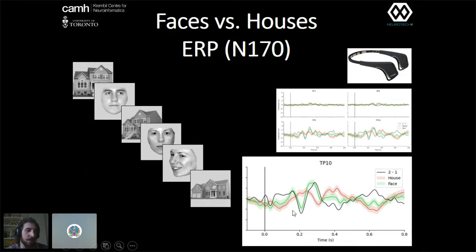So why is that? Well, two reasons for that. One is N170 is a ballpark, right? Everyone's visual face selective response isn't bang on 170 milliseconds. But the second reason is because we know that there is a little bit of a lag in Bluetooth wireless streaming. So this is a little bit of a weakness in the hardware stack that we're using here, that there are delays introduced that are fairly systematic, that we just have to account for in our interpretations.